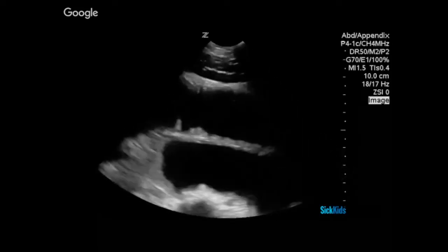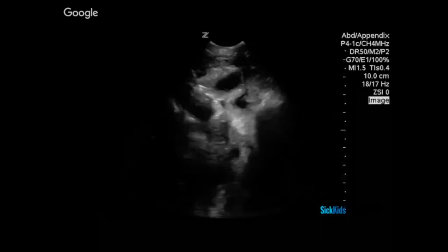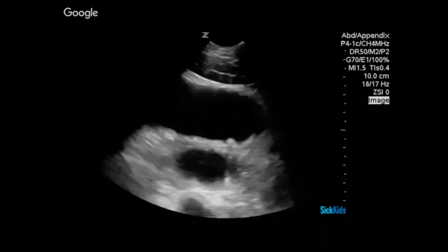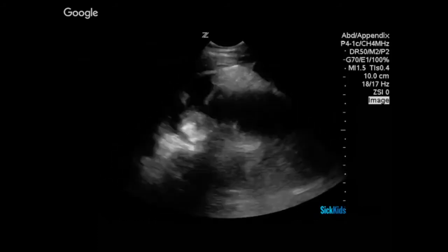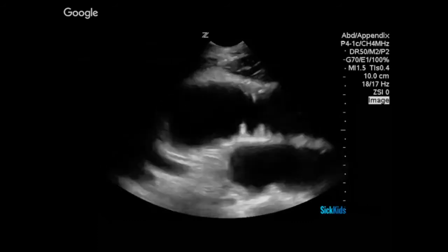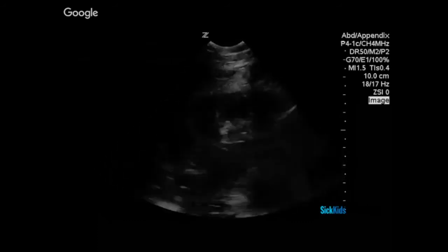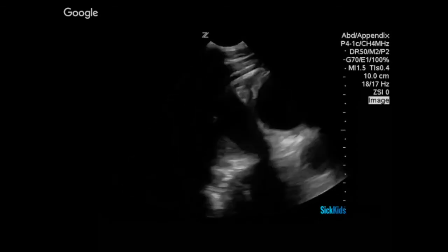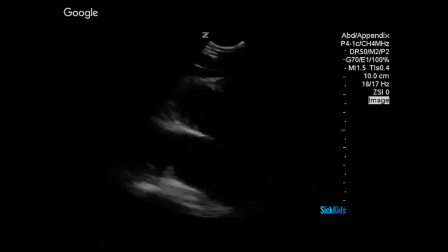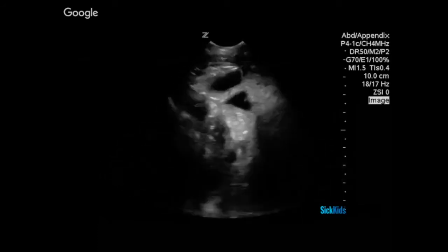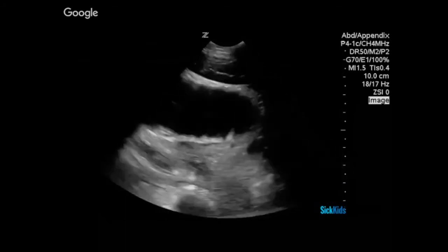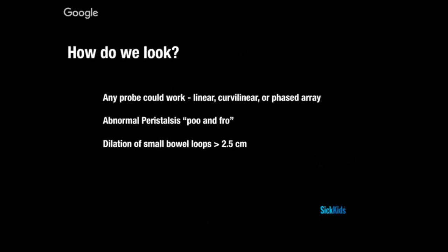What are we looking for? We're looking for features like large fluid-filled areas of bowel, abnormal bowel wall thickness, static or absent peristalsis, and abnormal findings surrounding the bowel. Any probe can work — linear, curvilinear, or phased array — depending on how deep you need to image and how large the patient is. In younger children we typically use a linear probe, but small bowel abnormalities can be found both deep and shallow.